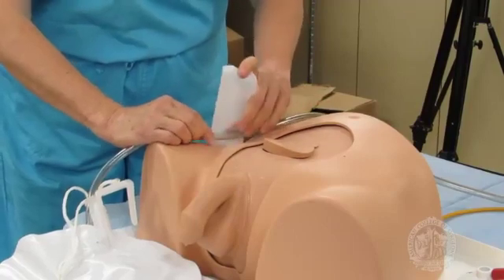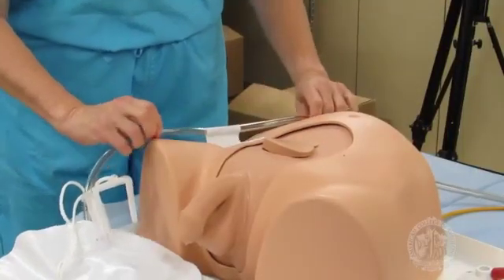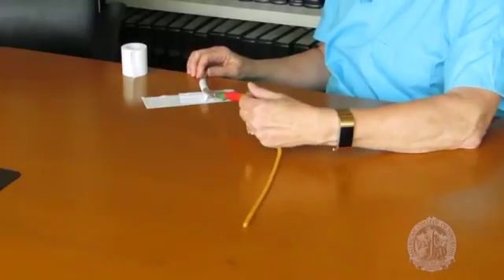Remove the drape. Now it's time to secure the catheter. Many kits come with a stabilization device — usually this device has a mechanism to lock the catheter in a single orientation and adhesive on the other side to secure it to the patient. If there's no stabilization device provided, use two pieces of tape to secure the tubing to the patient. The first piece of tape goes directly on the patient's leg under the tubing. The second piece of tape goes over the first, around, and is taped to itself before it's taped down. This provides a mesentery that provides a lot of stability for the tube. Whether using tape or a commercial stabilization device, leave enough slack in the catheter and tubing so there's no tension on the bladder neck.